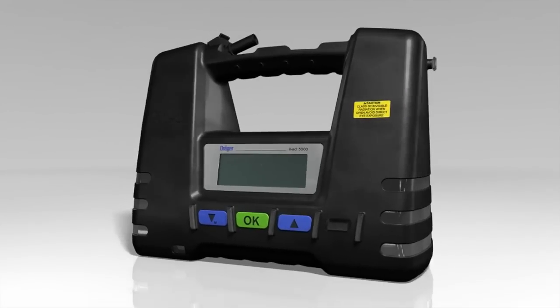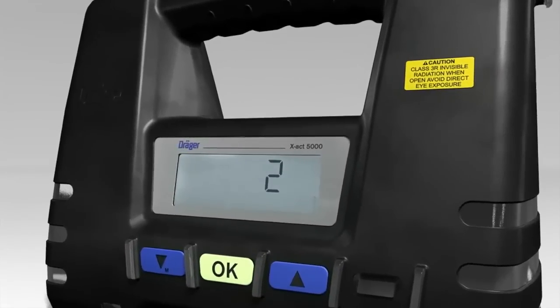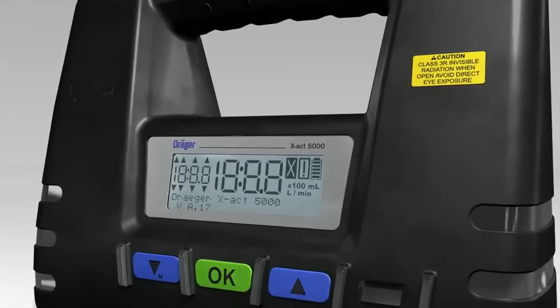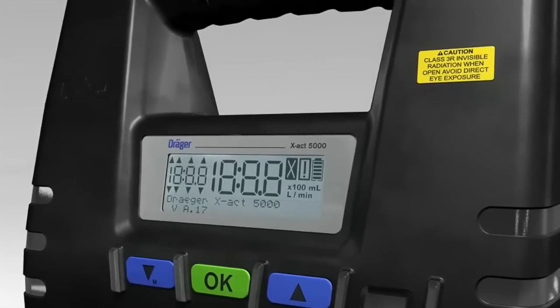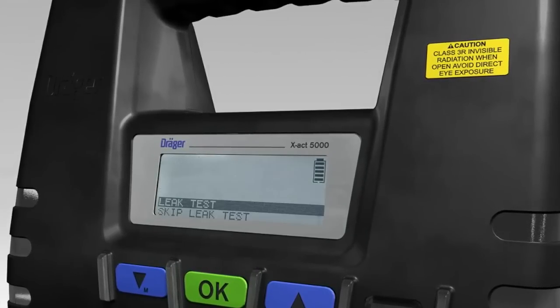Turn on the tube pump using the OK button. Keep the OK button pressed until the tube pump counts down from 3 to 1. As soon as you see this screen, the tube pump is switched on. The Dräger X-Act 5000 will now perform a self-test routine.